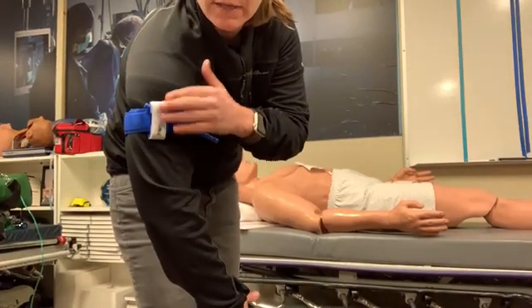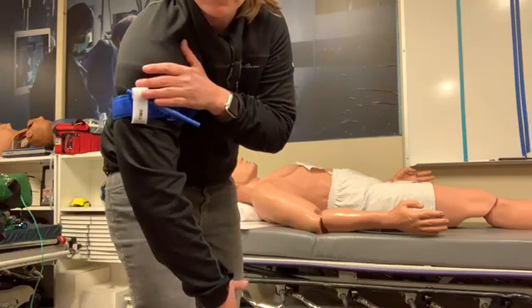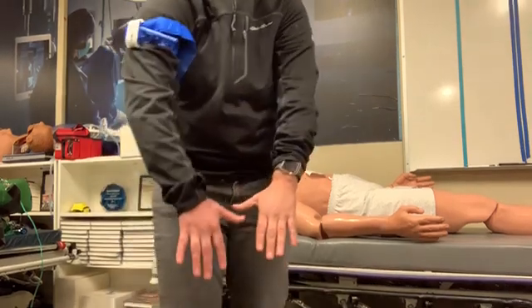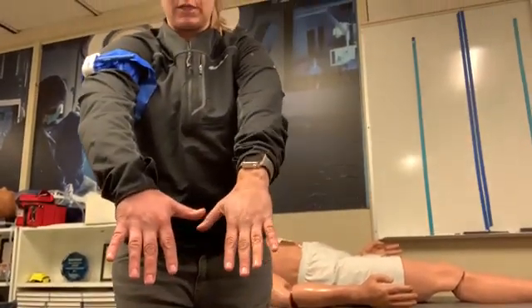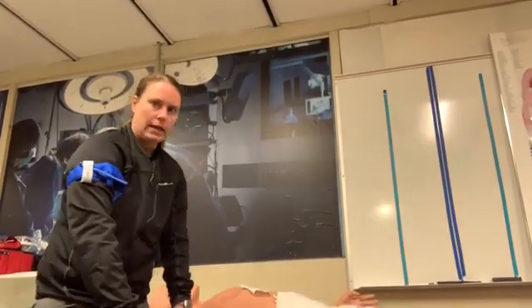In real life, there's a spot to keep track of time on here for how long this has been on the body. But they don't have you do that step, so you could verbalize that if you want. And you can see, even without me doing it super tight, a difference in constriction there on my hand a little bit.